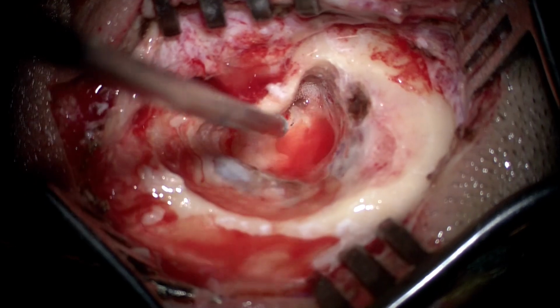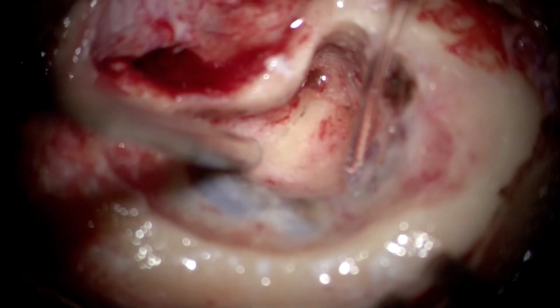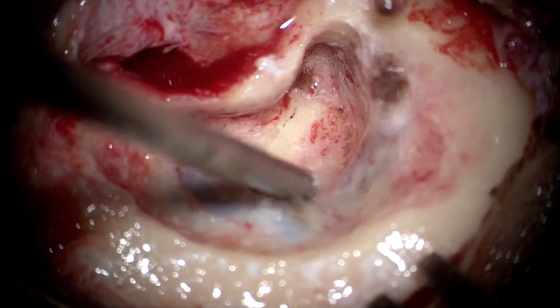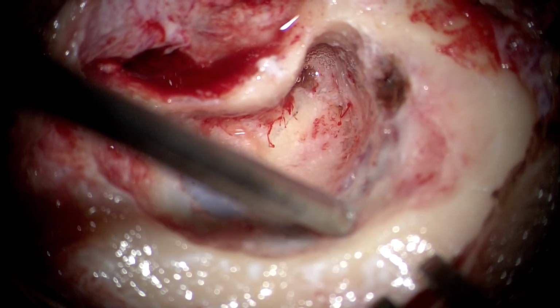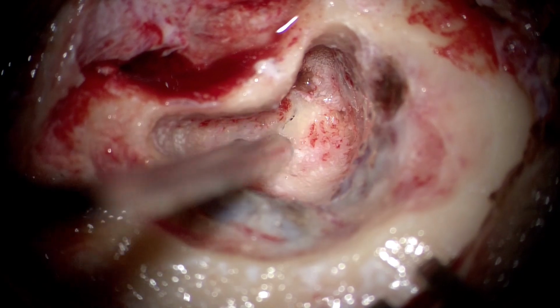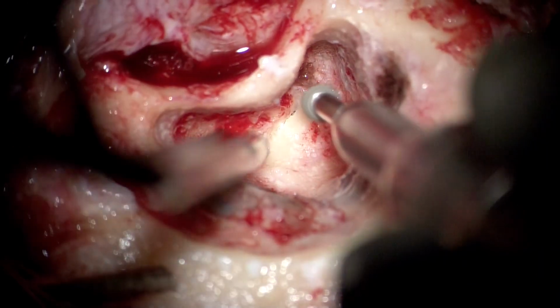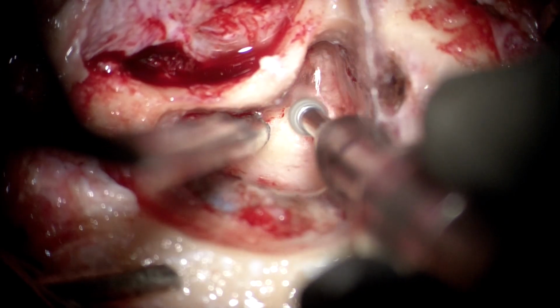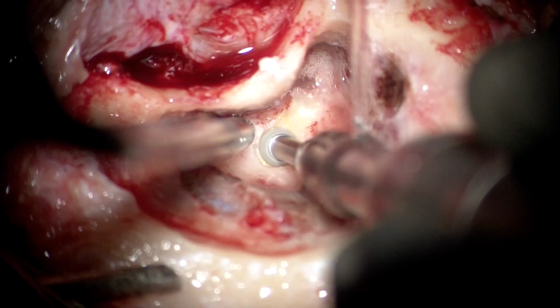We can see here that I'm using a large bore suction cannula with an irrigation channel and with excess irrigation from another assistant. This is because this wide bore suction cannula also leads to dynamic decompression or compression of the posterior fossa dura, like in these pictures. Also, because of the size of the suction cannula, it is quite safe and secure, and it does not lead to any accidental penetration inside the sigmoid sinus, which is now exposed.